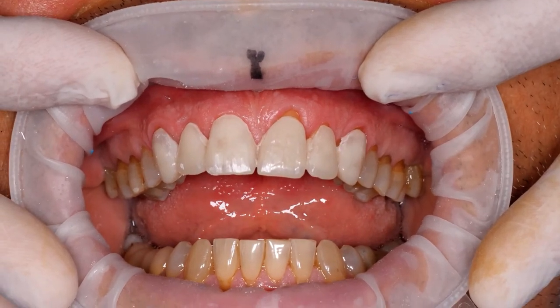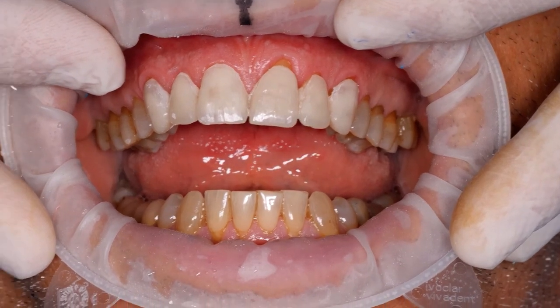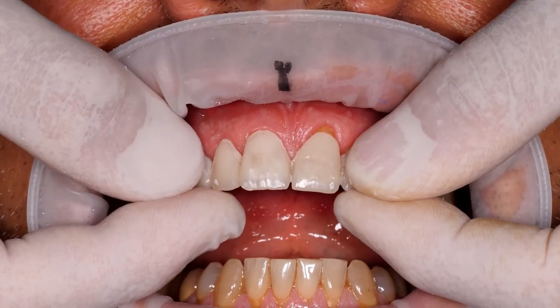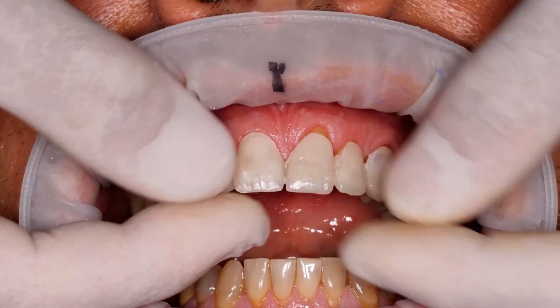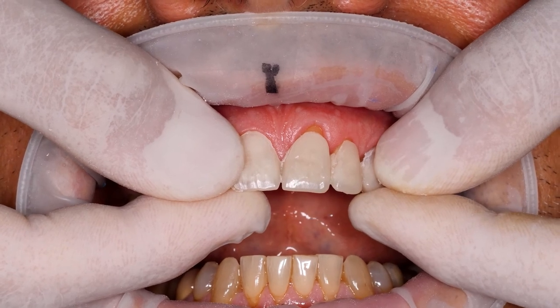So we try to improve the margins a bit, and also the shape and the whole thing. Dental assistant, shall we continue to work? Dr. Baccarini: yes, we'll continue to work. As a matter of fact, we can also work in the patient's mouth at this stage. I love working in the patient's mouth — Mauro said he likes to do it too — to get better control over the finishing margins.